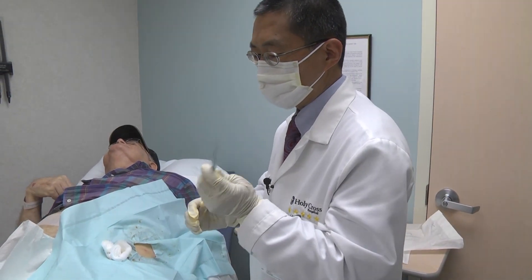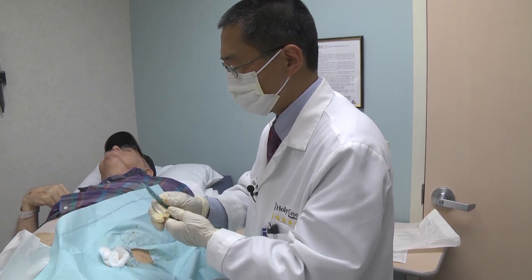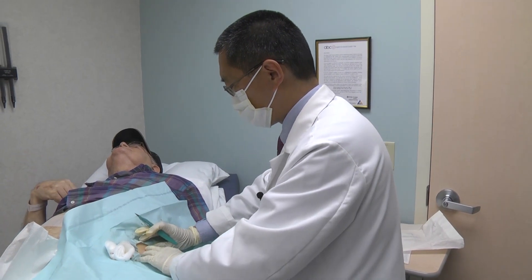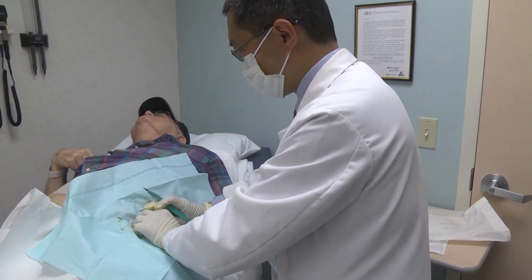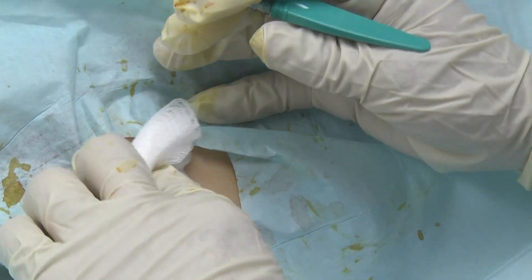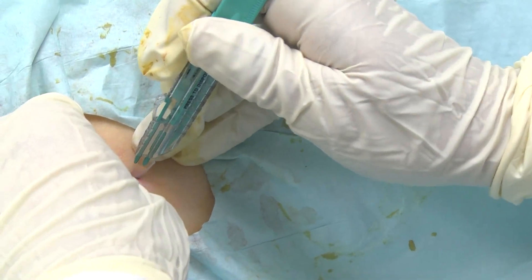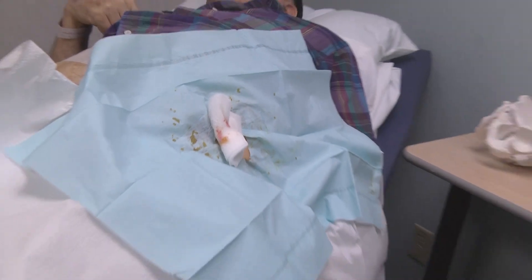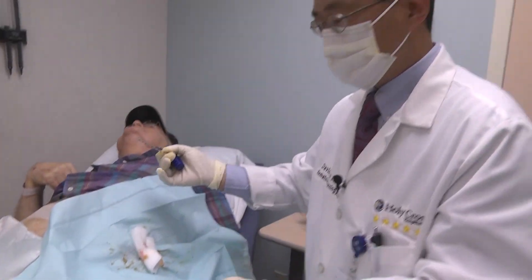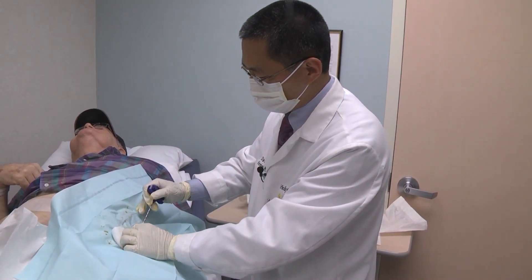Usually I have to use a scalpel to make a small nick before putting the needle in — it has a lot of advantages. It's a small, controlled nick. Try to feel the bone again. A small nick like this. No bleeding.